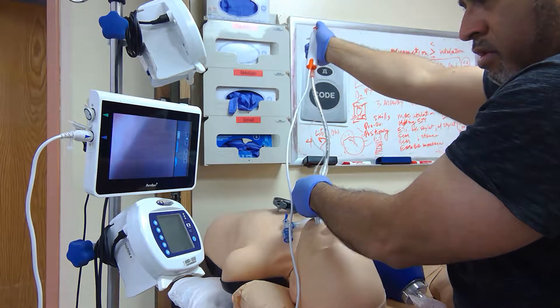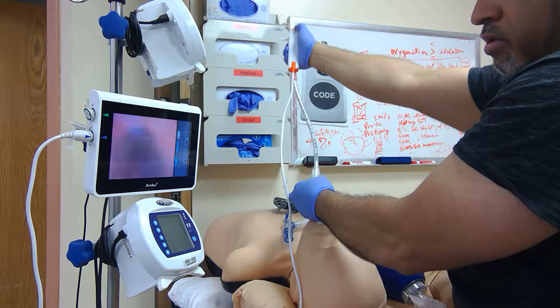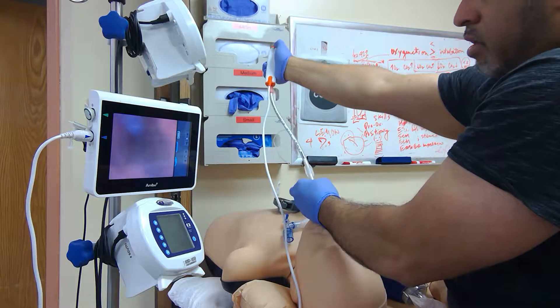It's in the sim lab which is in the hospital. Thread it through. You got it — as far as you can.